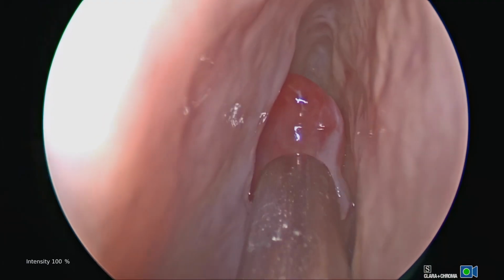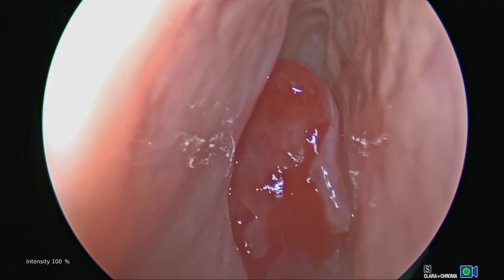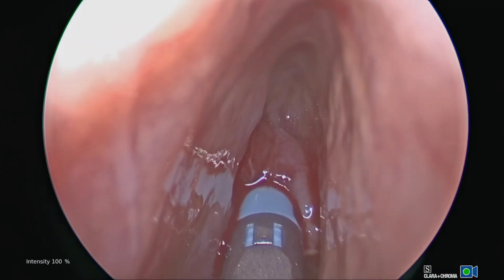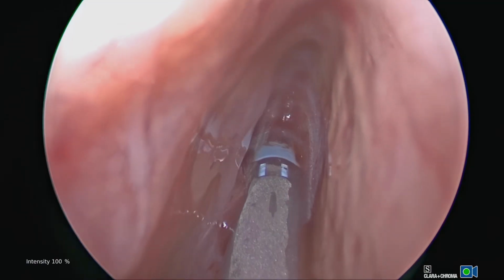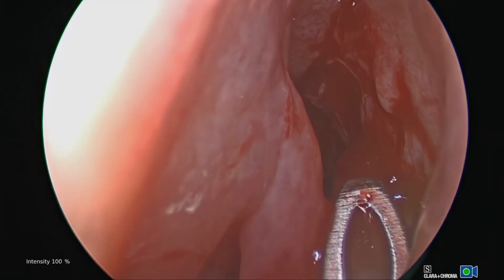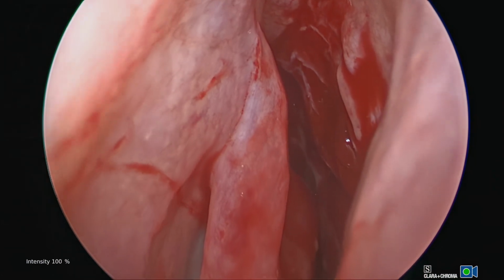A biopsy of a nasal lesion, by custom, is done in the operating room. So there was no reason to perform a separate biopsy prior to resection, and therefore the staging. You can see I'm using a tool called an Aquamantis. The Aquamantis is a bipolar with a self-irrigating system. I'm removing the lesion at its root.